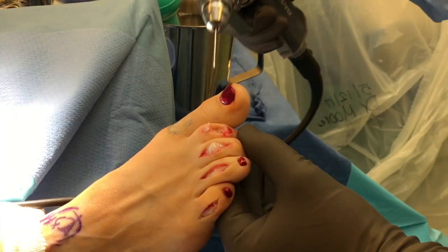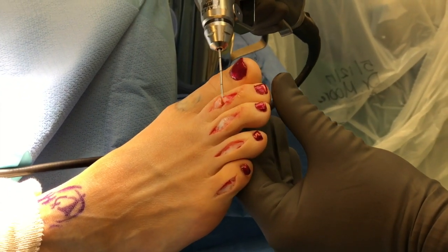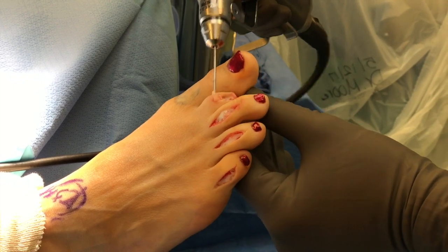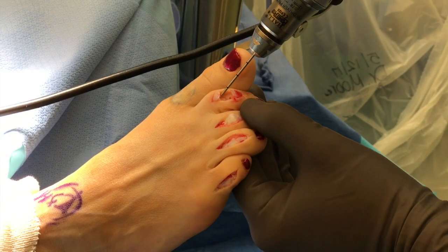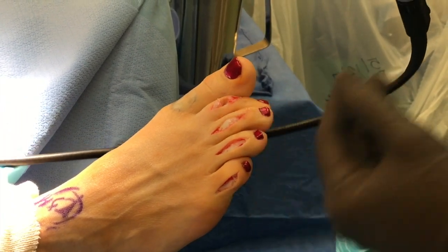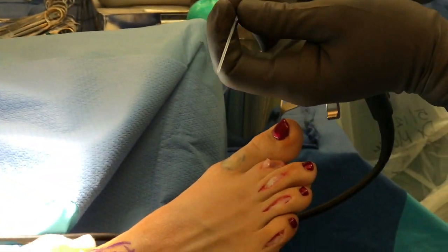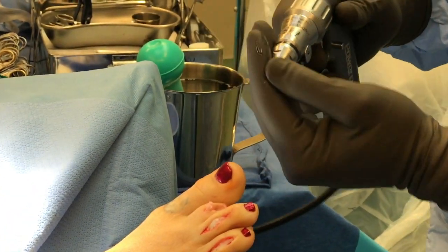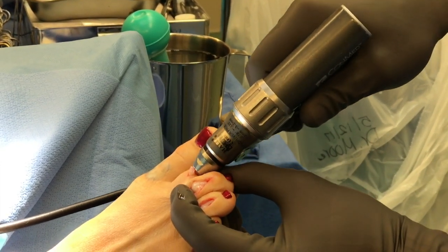This is the surface of the joint. The toe was straight — we resected the joint, and it's now shortened. To fashion the portal for the Trim-It pin, we have the drill here. We basically just make a small starting hole, and then we grab the Trim-It pin itself. It loads right back up in the same wire driver, and then we drill it into the proximal phalanx.